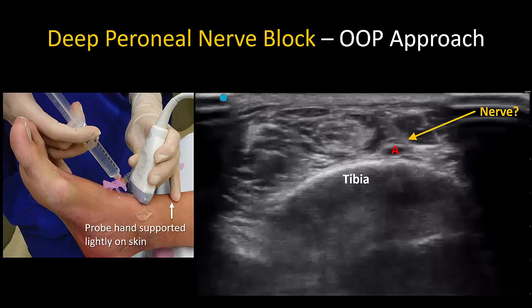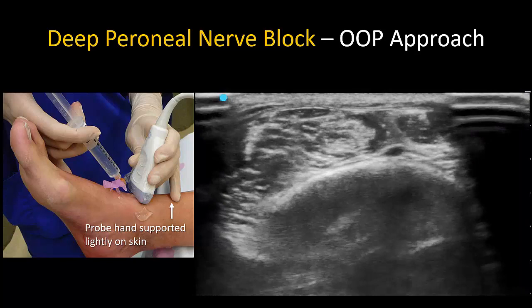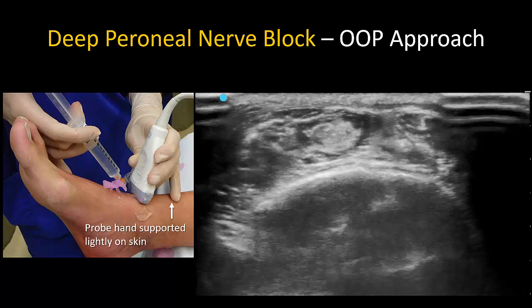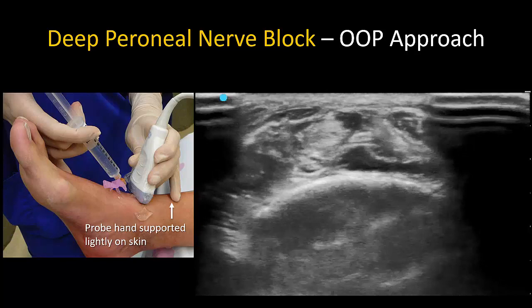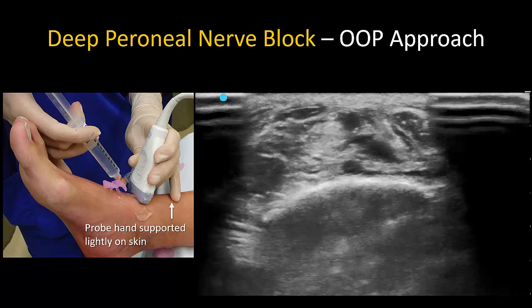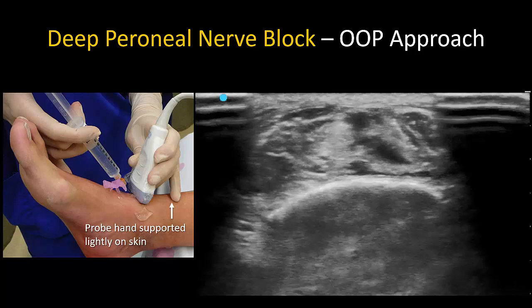This video demonstrates the out-of-plane approach. The artery is visualized as a pulsatile structure over the tibia. The nerve is usually adjacent, but sometimes on top of the artery as it crosses over from one side to the other. We start by advancing the needle well away from the location of the artery or suspected nerve, and gradual injection around the plane of the artery is done using a fanning injection technique where the needle is moved slightly in and out during injection. Five mils of local anesthetic is more than sufficient to cover the entire area. Note how the nerve that lies on top of the artery becomes more visible as the local anesthetic is injected.